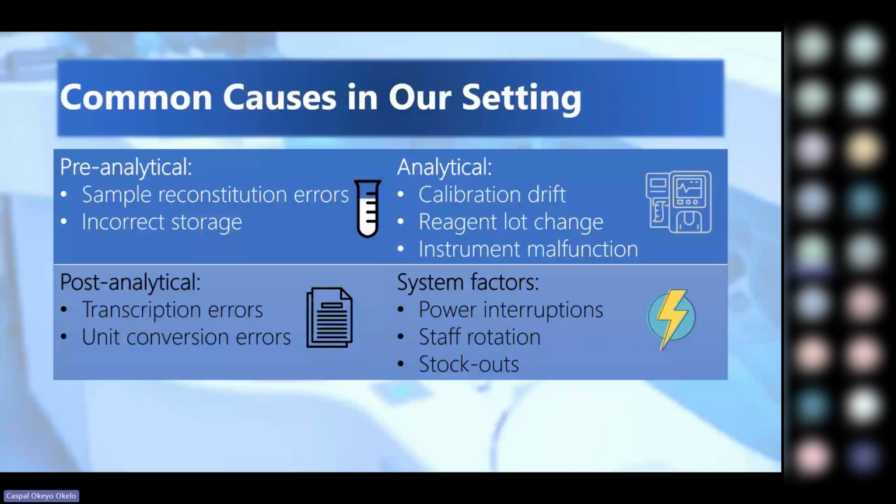And one of the most frequent causes that I've observed is failure to perform proper verification between reagent lots. And another common issue is assuming that if QC is within range, then everything is fine, even when there is a developing trend. Because QC within limits does not always mean the QC is stable.